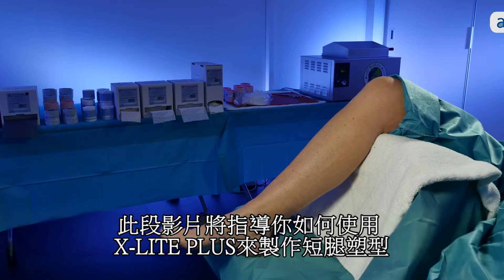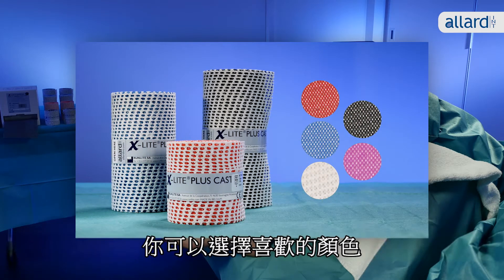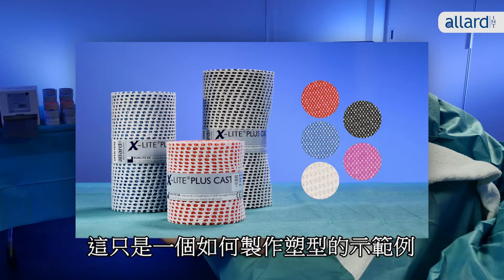This illustration will guide you through how to make a short leg cast in X-Lite Plus. You can choose between several nice colors. However, this is only an example of how to make the cast.